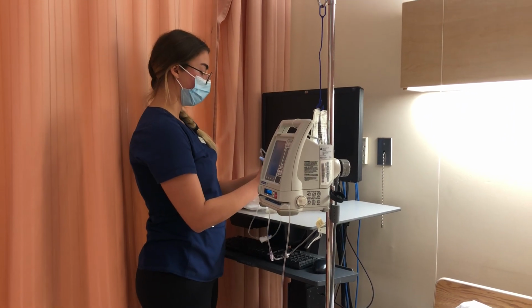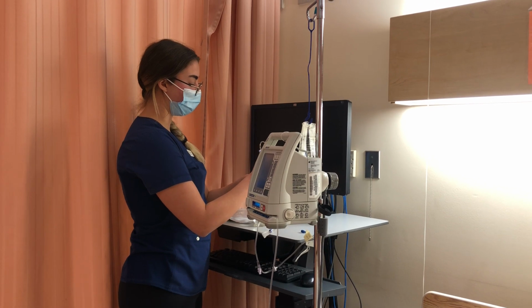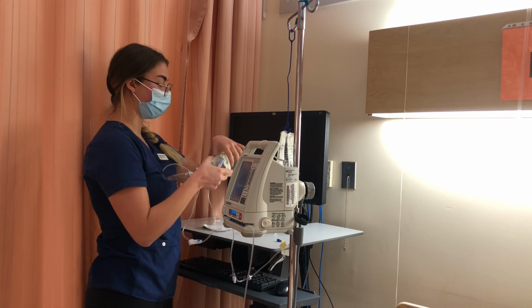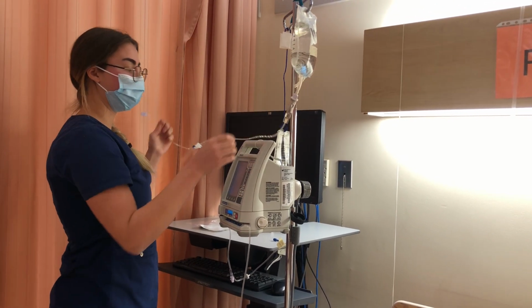So I'm going to choose an IV. And then maintaining sterility, I'm going to spike my bag. Because that is compatible with the solution that's already running. And then I can hang it. The patient doesn't really need the extra fluids, and administer over 15 to 30 minutes.